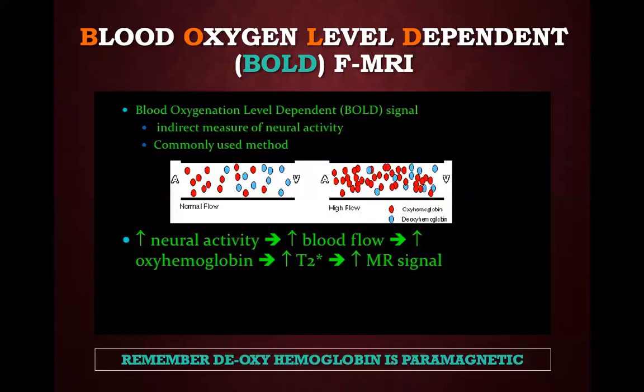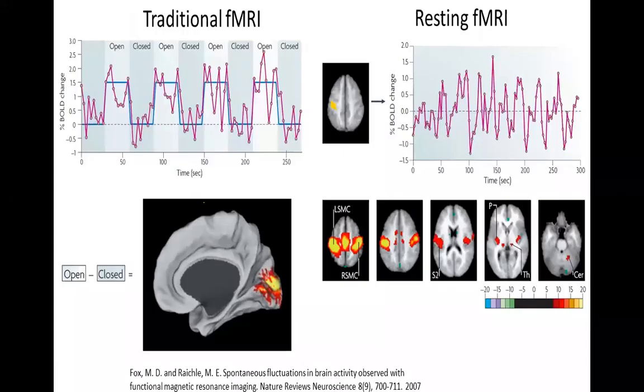For example, if I do a functional MRI and give you a picture of your girlfriend, the occipital lobe gets activated. That area will have hypermetabolism and will appear more active, receiving more oxygen. That is the concept of functional MRI.